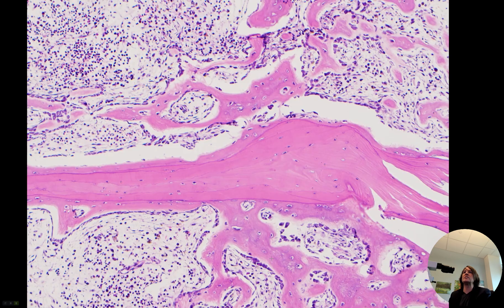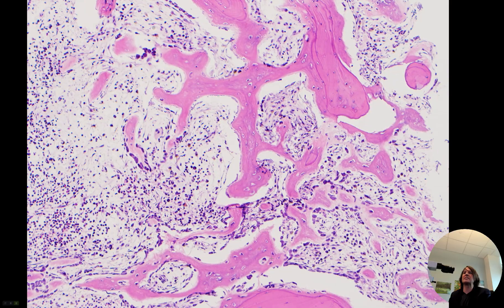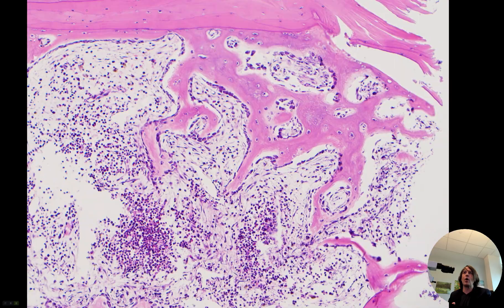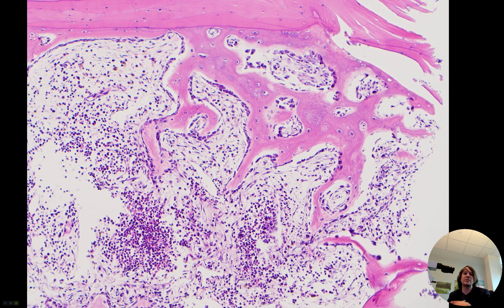Whenever we see this woven bone, that always tells me something is happening — this is not normal in the bone. Woven bone means some repair or some change, or sometimes some tumors make woven bone. But woven bone means something is happening: a reactive reparative process, a tumor, or something else. This is not normal bone; it's bone that's undergoing new bone production, and that usually means something's happened. So whenever I see this on a biopsy, it's usually a meaningful finding.